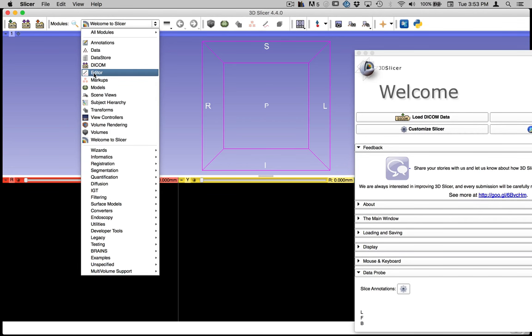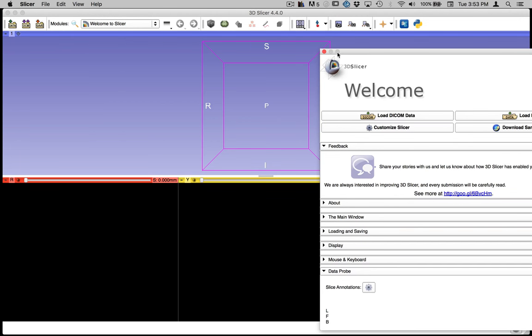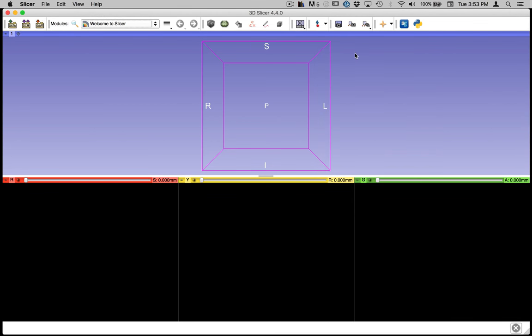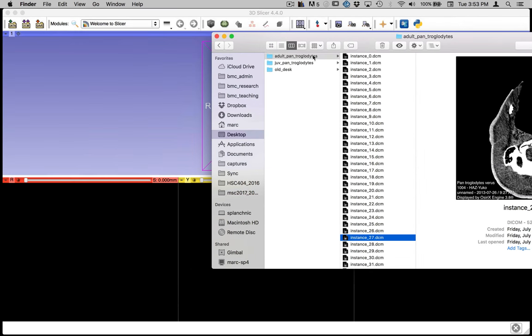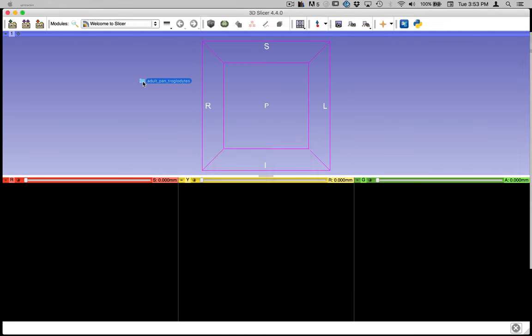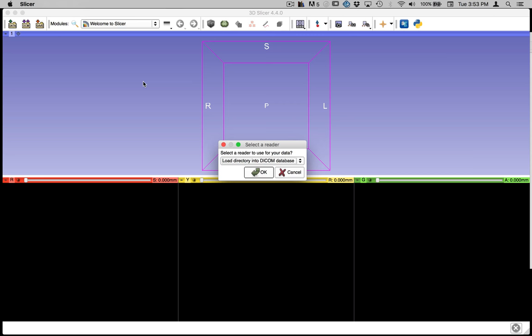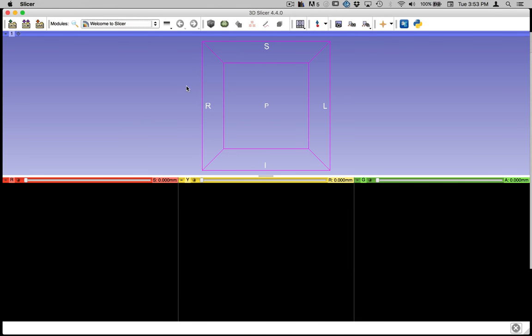So let's first start and look at how we get data into 3DSlicer. And the simplest way to do it is the drag and drop method. So once you download these stacks of DICOM images, you can simply grab the folder that houses them and drag it into this environment. So you'll be asked what reader you want to use. So you can just say OK to the first option here, load directory into DICOM database.